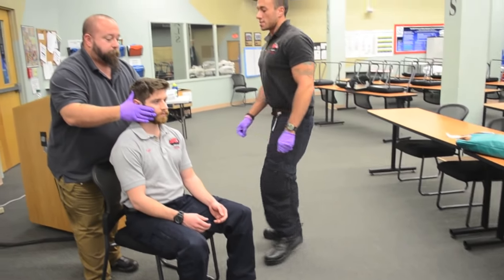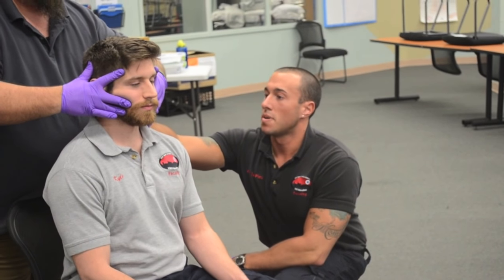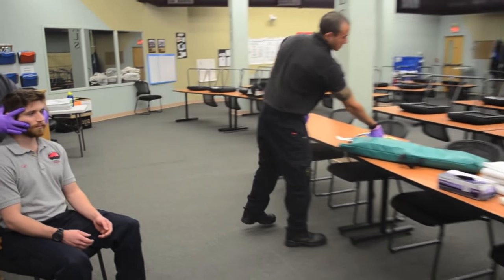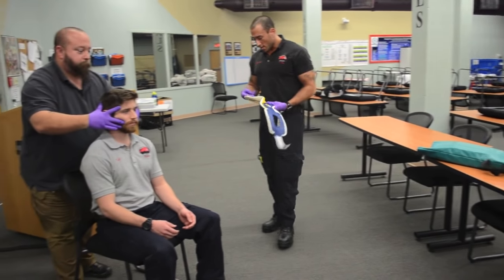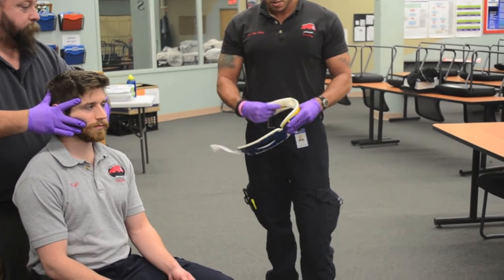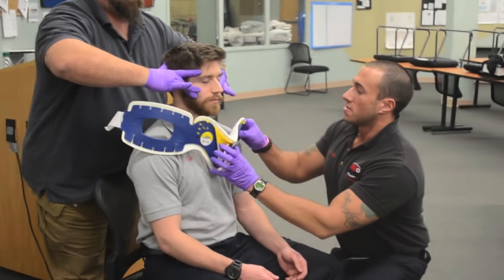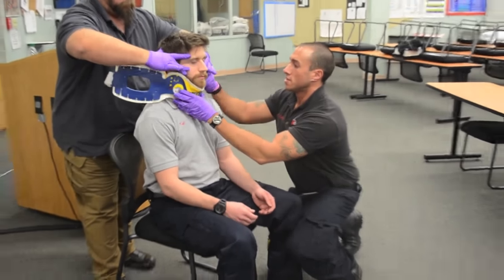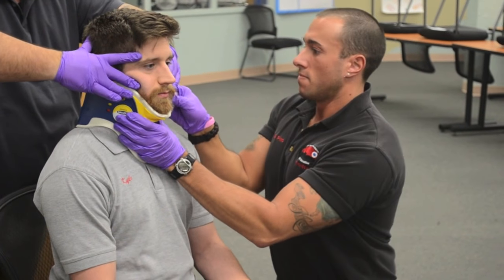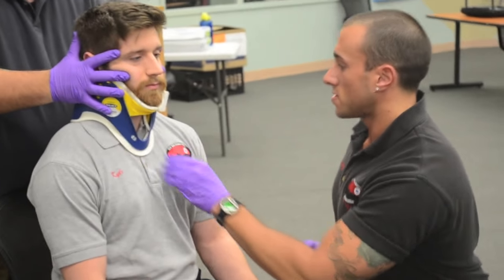At this time I am going to size a proper extrication collar by measuring from the top of the trap to the bottom of the jawline. I am going to measure and set my extrication collar to the proper size. Starting from the patient's sternum, working out encompassing the chin, then securing and making sure the chin is in inline stabilization with the sternum.